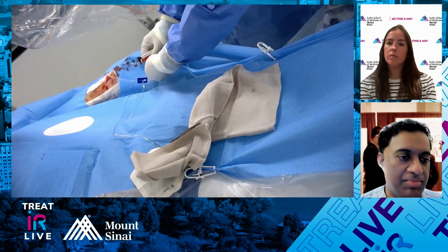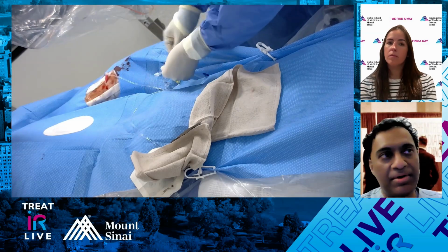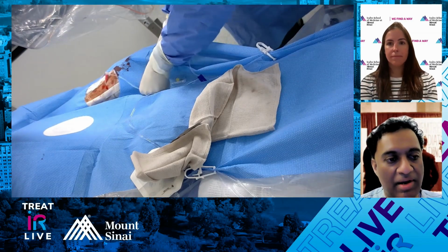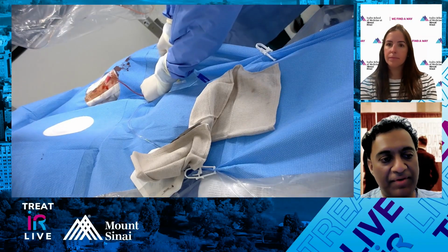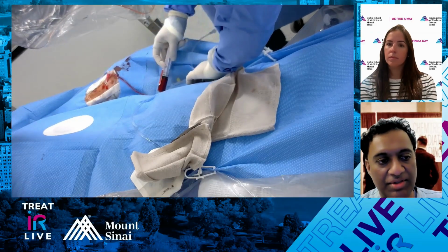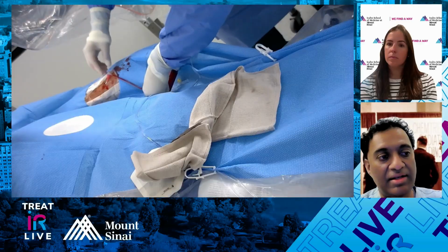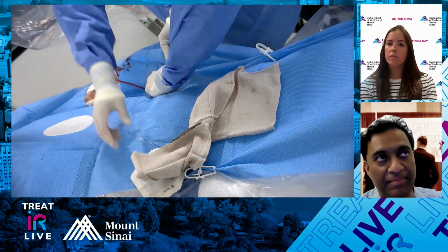But we can also do preservation of the hypogastric, and depending on the diameter of the limb, the Gore graft has a 23 proximal. It's 3 centimeters to the bifurcation, and then a 2.5 for the hypogastric going in. Then a 10 centimeter or 12 centimeter long ipsilateral side. So you could deploy that, and it's a fairly flexible stent, provided you have about 5.5.